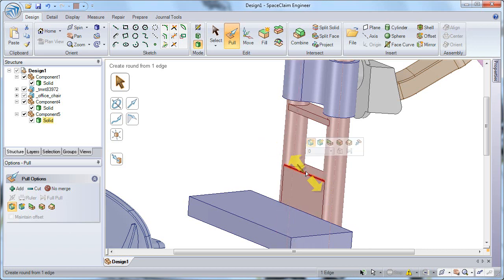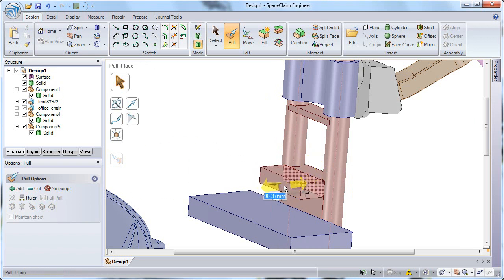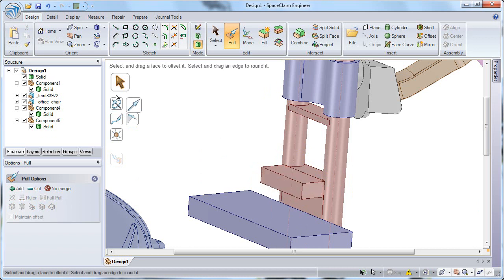But if I click and go to my mini tool guide, I can choose to extrude the edge, copy the edge, or pivot the edge as well. So I'm going to show the Extrude Edge tool. You'll notice that based on the direction that I'd like to extrude that out, I can extrude that into a surface. Then if I choose the other direction, I can extrude that down into my body, creating a surface in my structure tree. I can then pull out that new surface that I created, creating a solid in my structure tree. And now let's create a new component to fit that solid into.